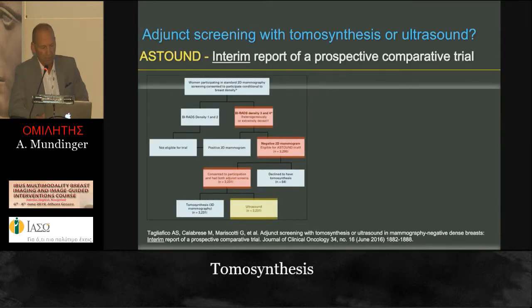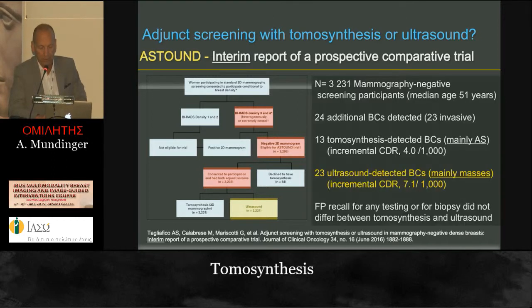And there is a very important interim report of the ASTOUND study, a prospective comparative trial that compares ultrasound and DBT in mammography negative participants. The important message is, of these 24 additional breast cancers, 23 were ultrasound detected and only 13 were DBT detected. In other words, there were similar results for the other performance parameters. Ultrasound still has a very important role.